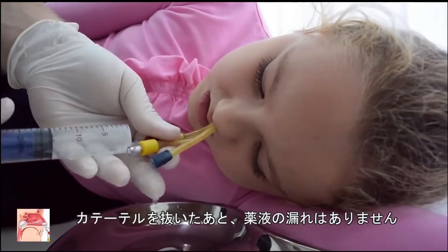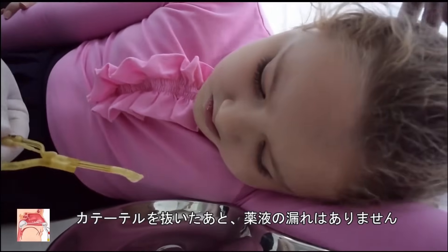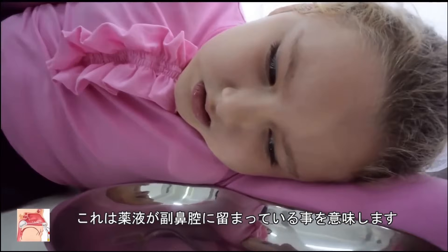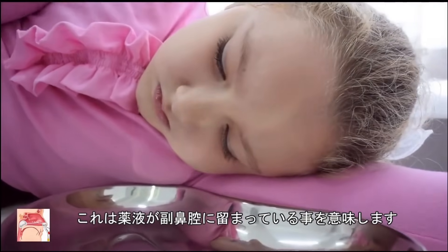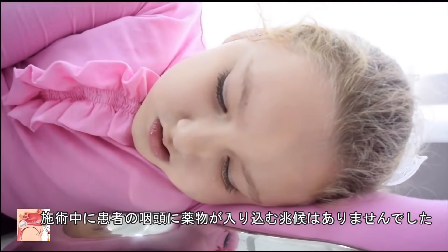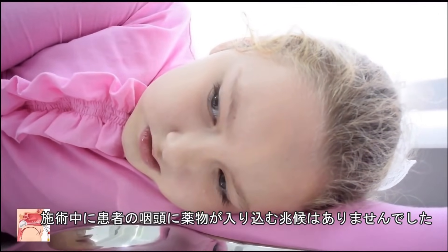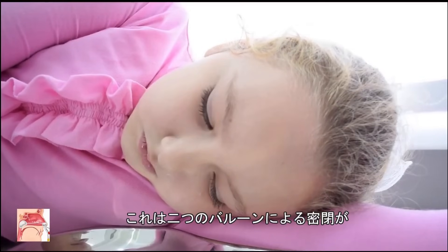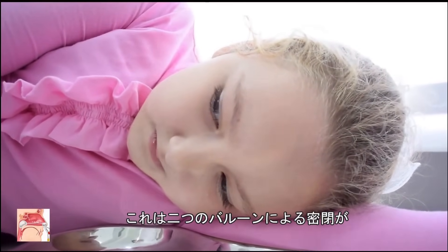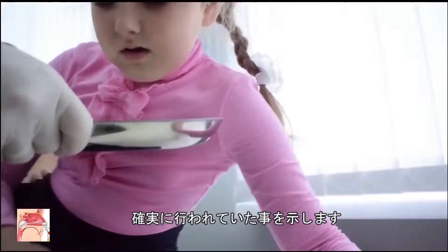There is no nasal discharge after catheter removal, meaning the entire drug stays in the sinuses. During injection, there were no signs of the drug getting into the patient's pharynx. This is indicative of the fact that the solution did not proliferate beyond the area restricted by the inflated balloons during the procedure.